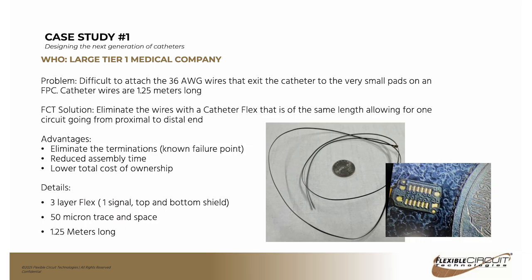So there's a quarter there for reference on both images. And as you can see, the one end there is very, very small, where you're just catching the edge of the quarter. This particular one had 50 micron traces and spaces and was 1.25 meters long.